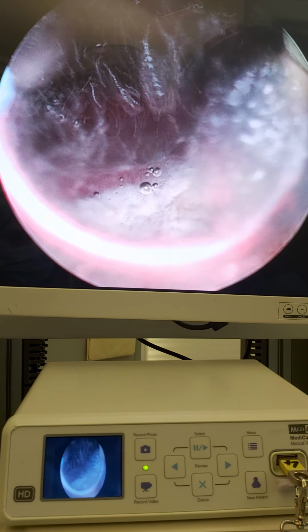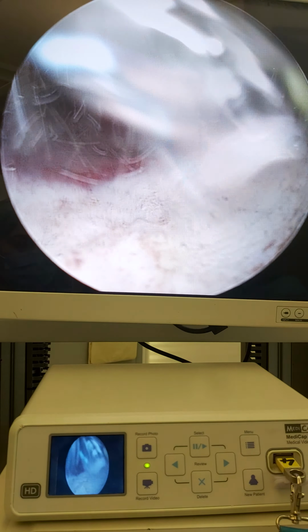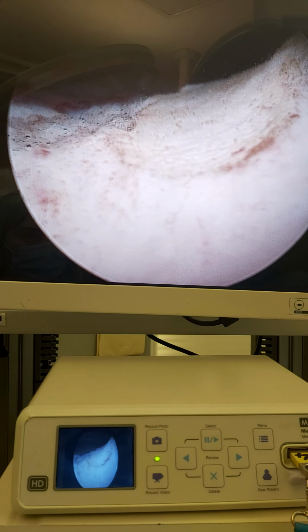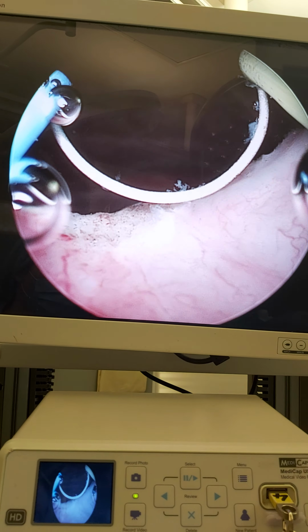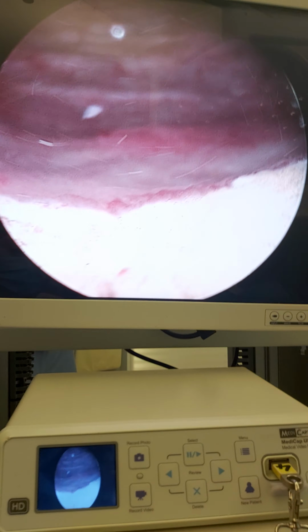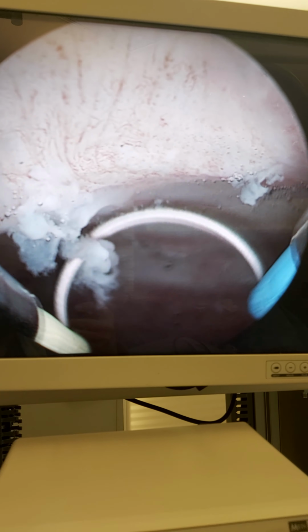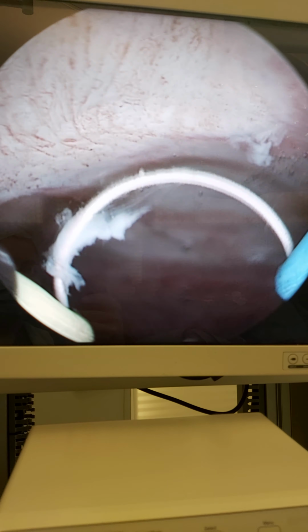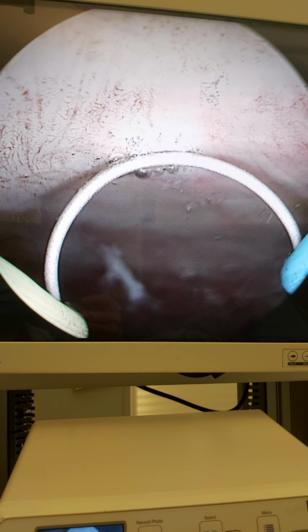And this is the resection type. It makes maybe deeper penetration and takes out the tissue better. But we have to be very careful doing this. And this is the upper part. You see, when I fulgurate, I see some leukoplakia tissues in the upper part. Yeah, they are.